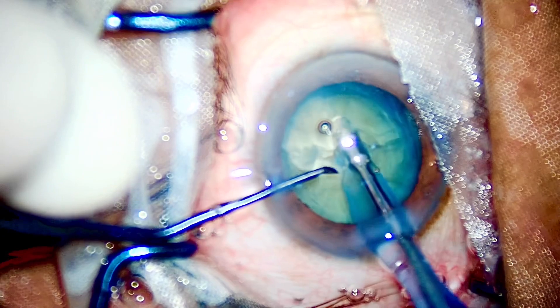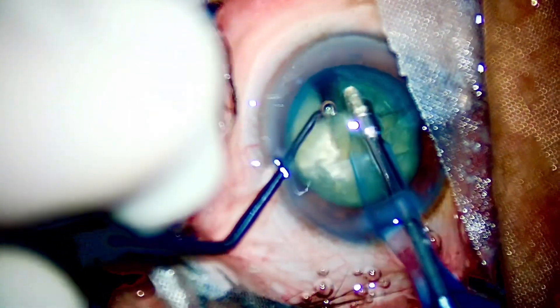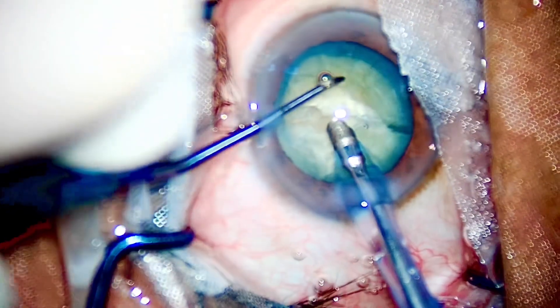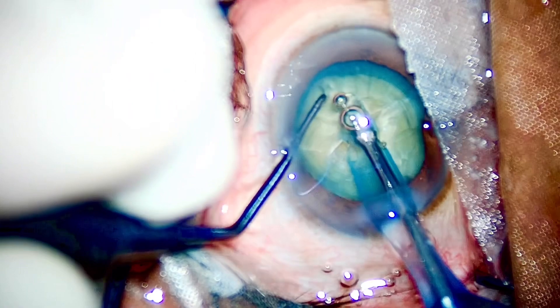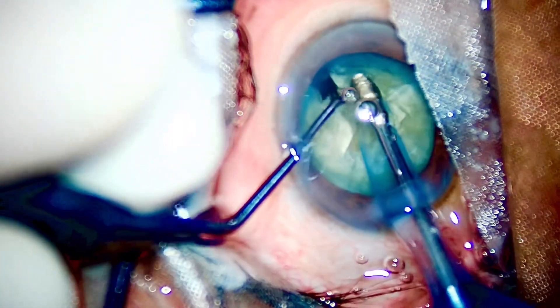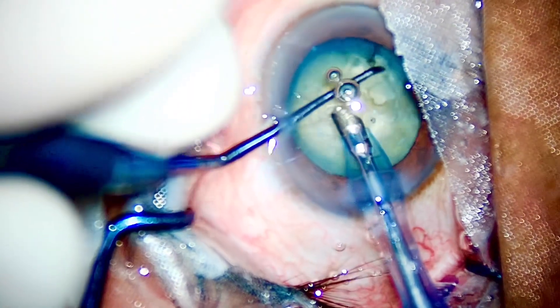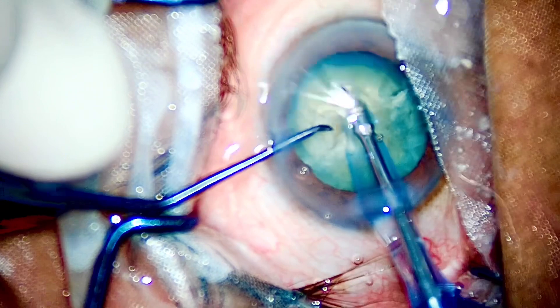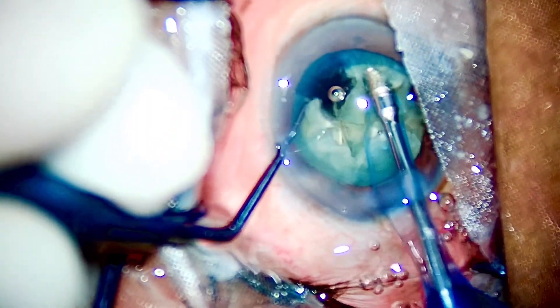My horizontal chop also makes some contribution. Once again, I'll go deep into the endonucleus — bevel down is very important for a good purchase into the endonucleus. Once you have a good purchase, just throw those cracks with your chopper. The procedure becomes really easy if your technique is right. You can go back to the diagrams I showed you, grab a screenshot, and show it to colleagues and friends who are about to learn phaco.